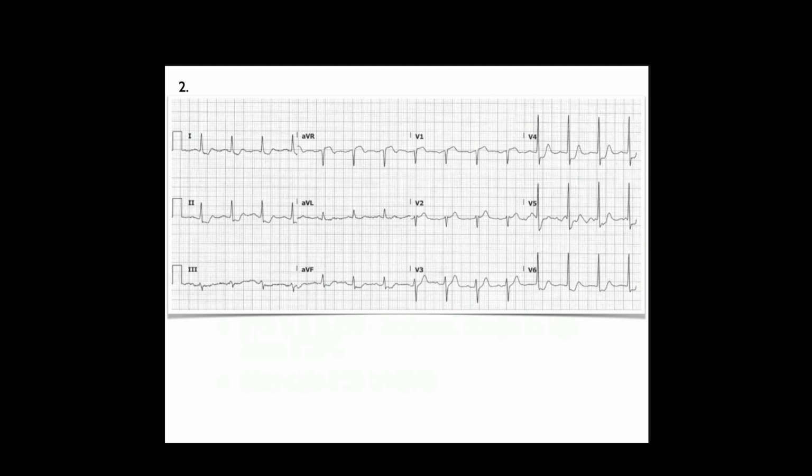Yeah, it is hard. I think I still would call it, because you have to say the TP segment is sort of here and here, and it does seem, even though it's low quality, that as you correctly say, it's flat and a bit lower than the isoelectric line. Same thing in AVL, it's hard to call it depression, but it's definitely got a flat ST segment. Correct, I agree with that.